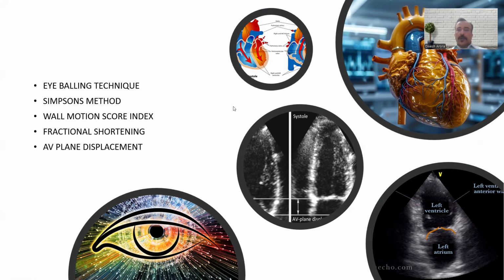I was speaking to a cardiologist friend of mine, and they told me that eyeballing technique is the method which they use most commonly during day to day practice. And this is the one which, as anesthesiologists, for doing a POCUS examination for assessment of LV, we are going to use as well.